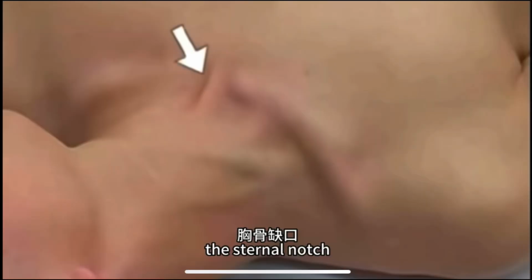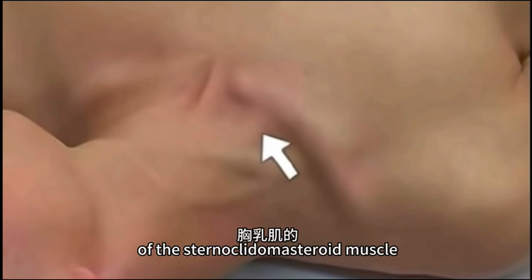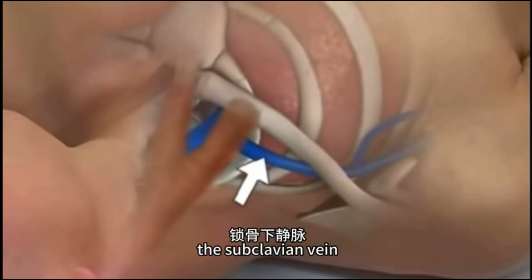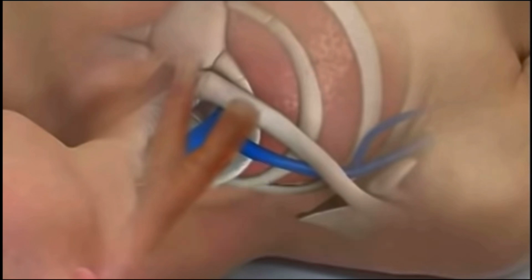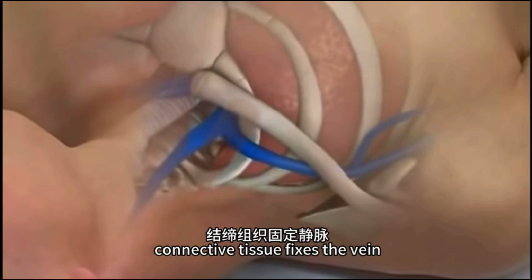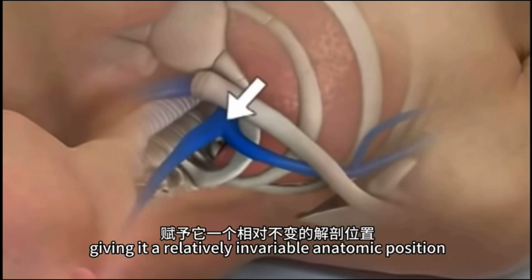The sternal notch, the clavicle, and the clavicular head of the sternocleidomastoid muscle. The subclavian vein lies posterior to the medial portion of the clavicle. Connective tissue fixes the vein between the first rib and the clavicle, giving it a relatively invariable anatomic position.